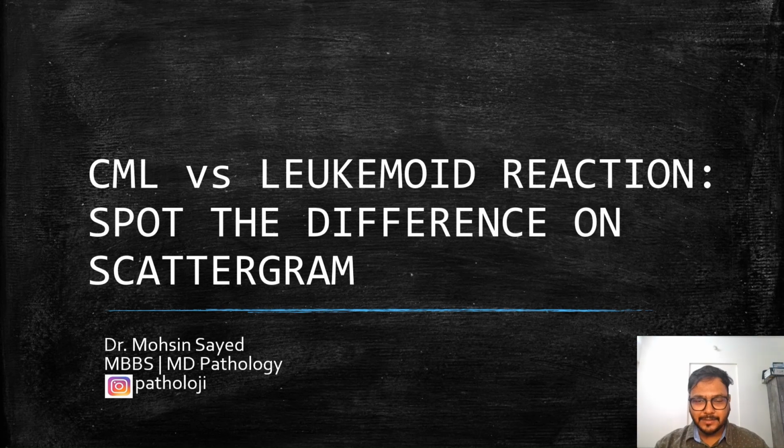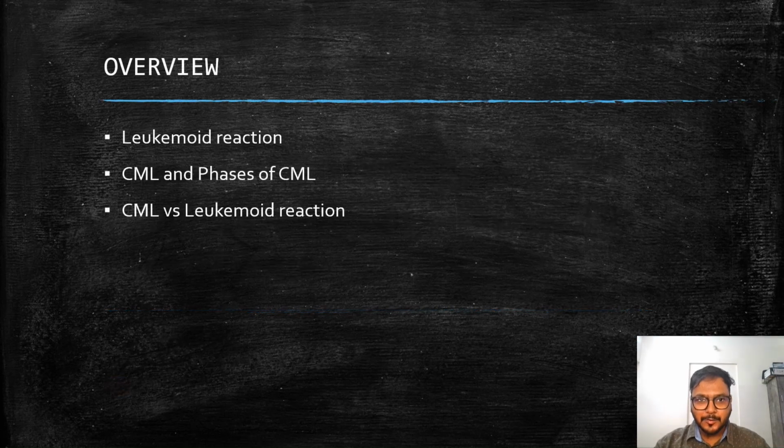Today I'm back with another video in which we'll be discussing the difference between CML and Leukemoid reaction based on scattergram. We'll be proceeding in the following heads. First, we will be discussing Leukemoid reaction in brief, then we'll discuss CML and its phases, then we'll come to the actual topic which is CML versus Leukemoid reaction.